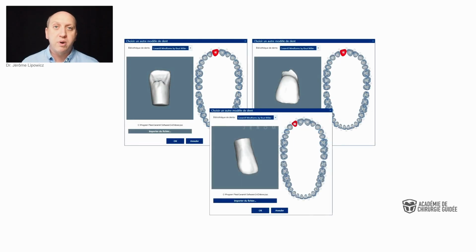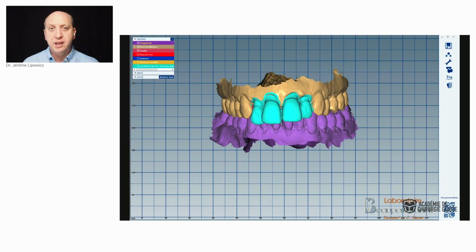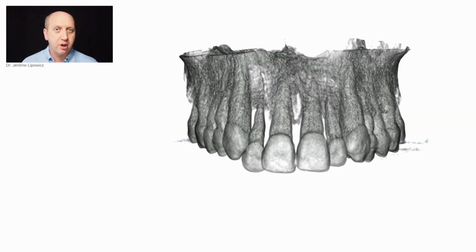Since the teeth were healthy, the dental technician proposed to create a custom teeth library. He did a great segmentation work on the exocad software. He captured each tooth in order to create that library. And he went from this and he achieved that again with a wax up using the original teeth. So you know now how it works.